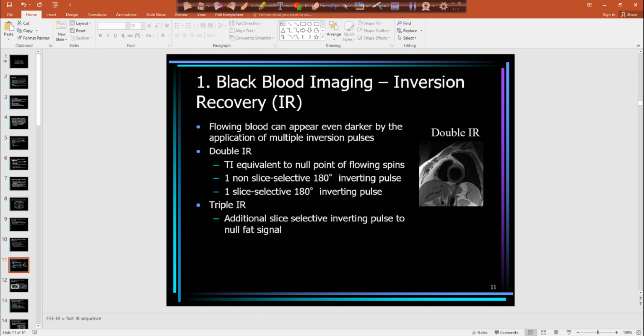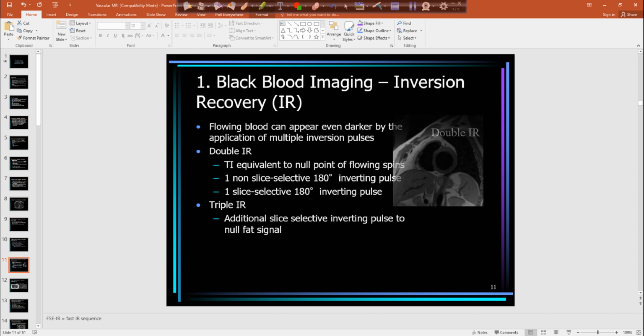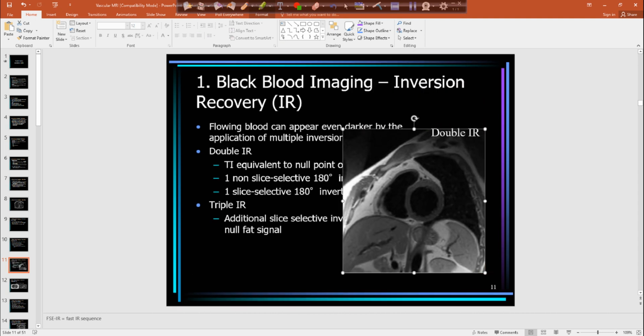So which type of slice do you think we have here? I know you guys haven't done much cardiac, but which chamber do you think is this right here? Isn't that just the left ventricle? It's the left ventricle. So this is what we call a short axis view. We are doing an oblique slice through the ventricles, and we have the left ventricle and the right ventricle here. Remember that the right ventricle was more anterior. Here's the front of the patient. That left ventricle was a little bit more posterior. We could really see those chambers well in profile. This is called a short axis view.